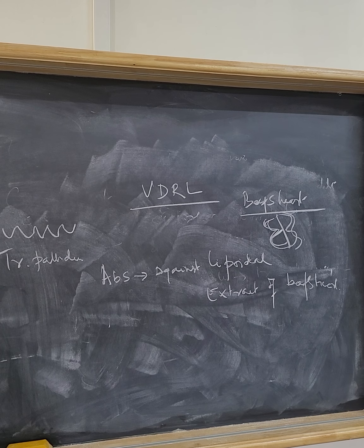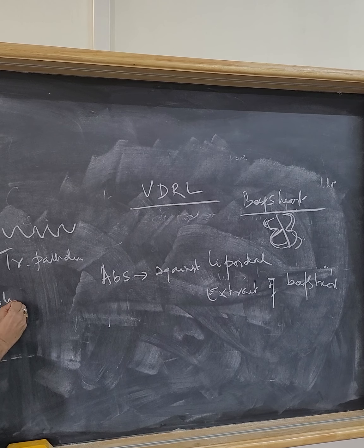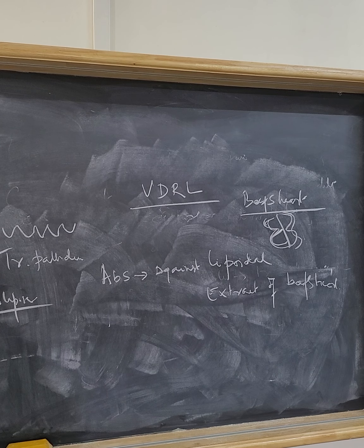So the lipoidal extract you take is called cardiolipin.